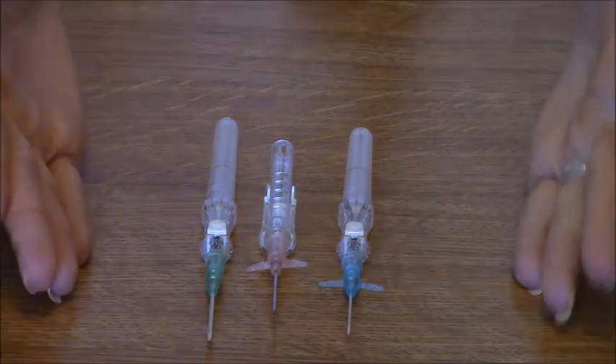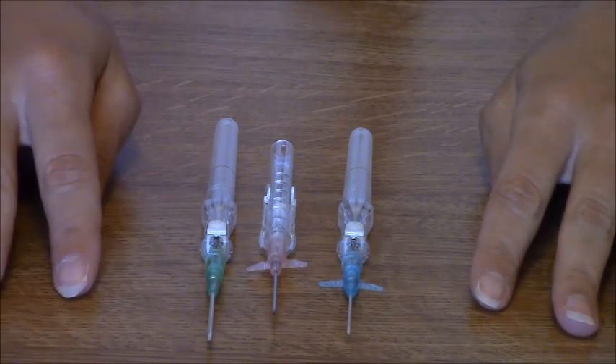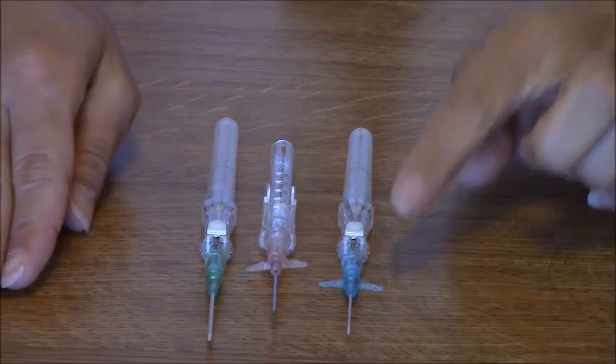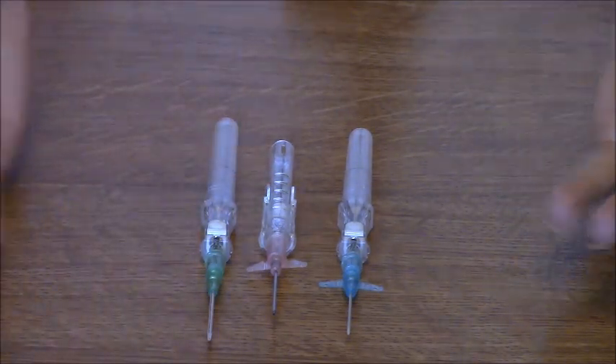As a nurse, you will be using these so much that you will memorize these different colors, but when you first start out you'll be a little confused. There's a little rhyme you can memorize: blue is 22, green is 18, and then pink is in the middle.